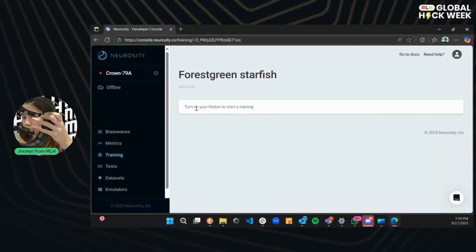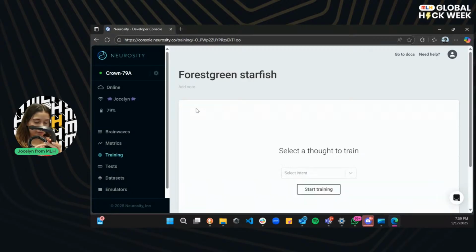I don't know. Let's see. It's actually easier when you use devices that are not connected through the internet. Most of the devices that I've used before use just Bluetooth, so you only pair it with your Bluetooth. Doesn't matter if you have an internet connection, and then you get it working. But I think this one works a bit different.